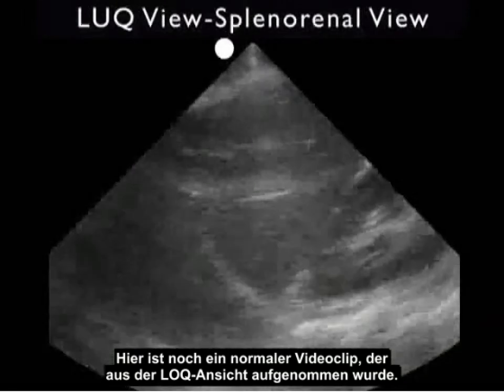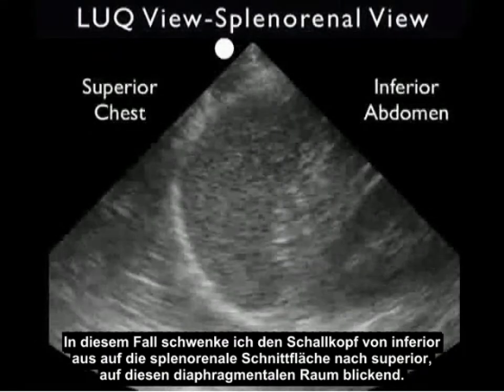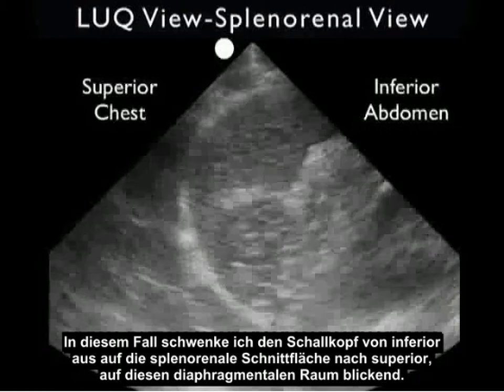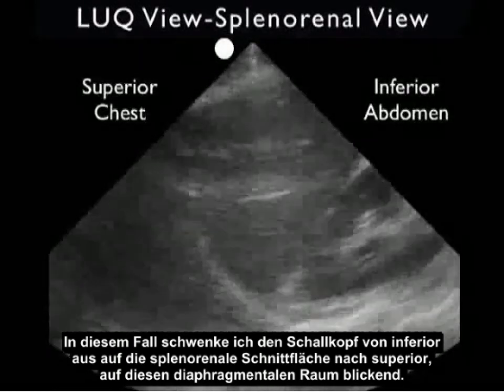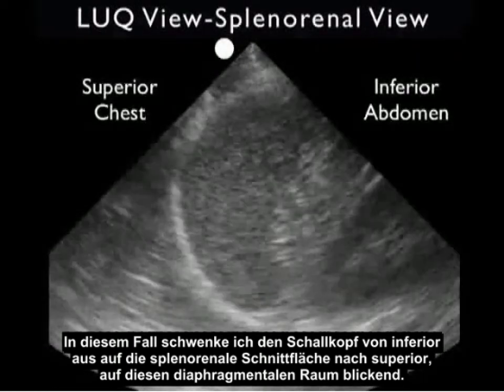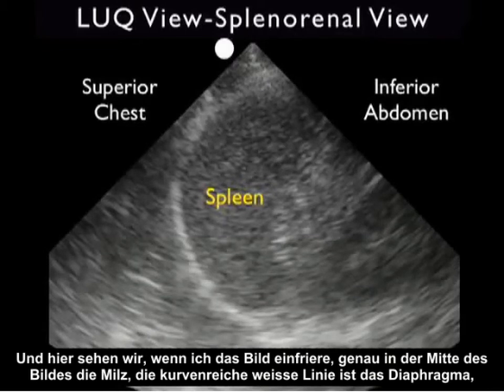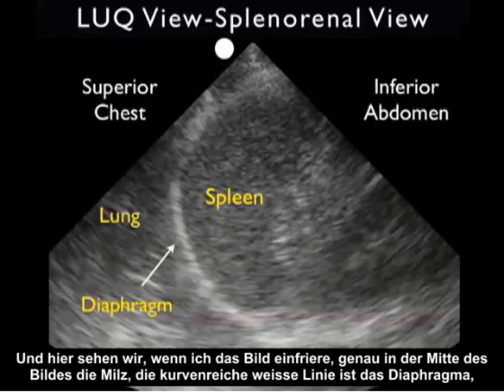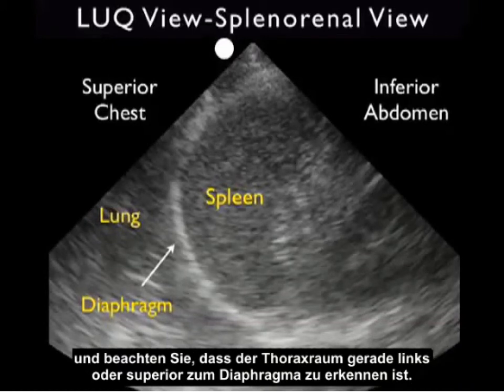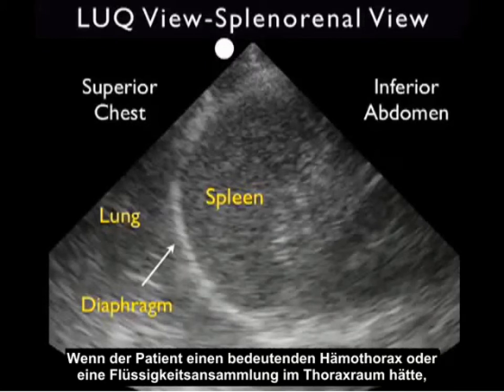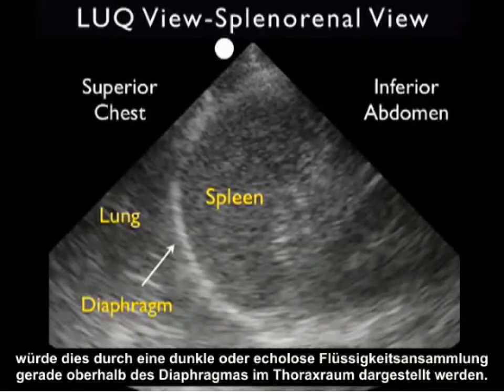Here's another normal video clip taken from the left upper quadrant. I'm swinging the probe from inferior — looking at the splenorenal interface — to superior, looking at that infradiaphragmatic space. We see the spleen in the middle of the image, the curving white line making up the diaphragm, and the thoracic cavity just left or superior to the diaphragm. If the patient had a significant hemothorax, that would appear as a dark or anechoic fluid collection just above the diaphragm in the thoracic cavity.